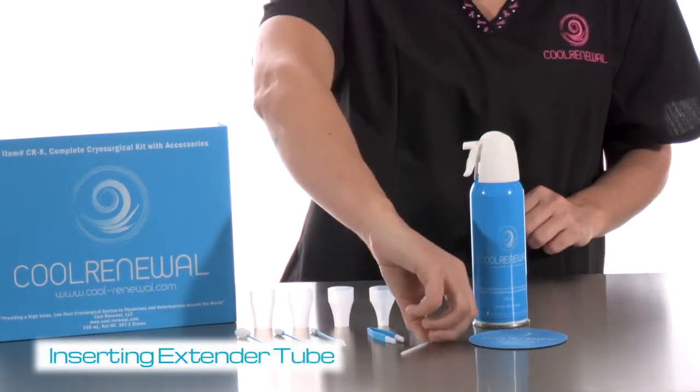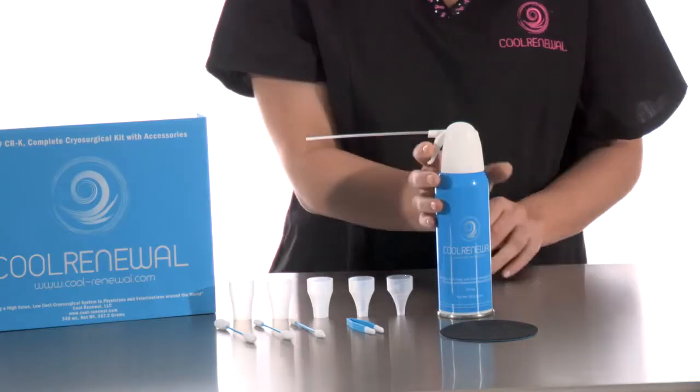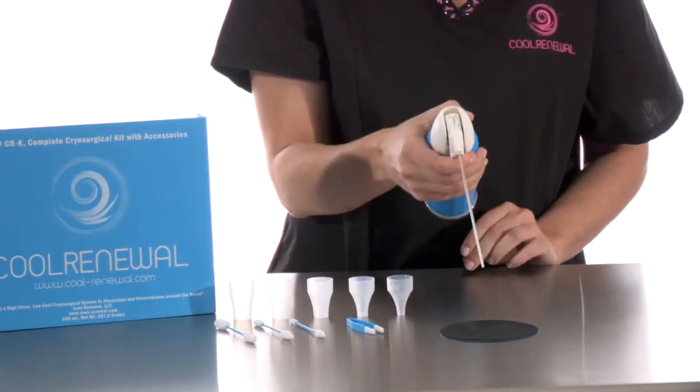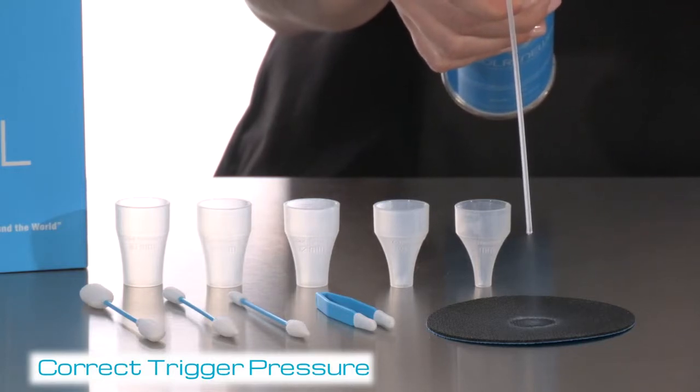Insert the clear extender tube into the round opening in the white trigger nozzle. Test the canister by pointing the extender tube towards the ground and gently pulling the trigger to ensure the extender tube is secured.